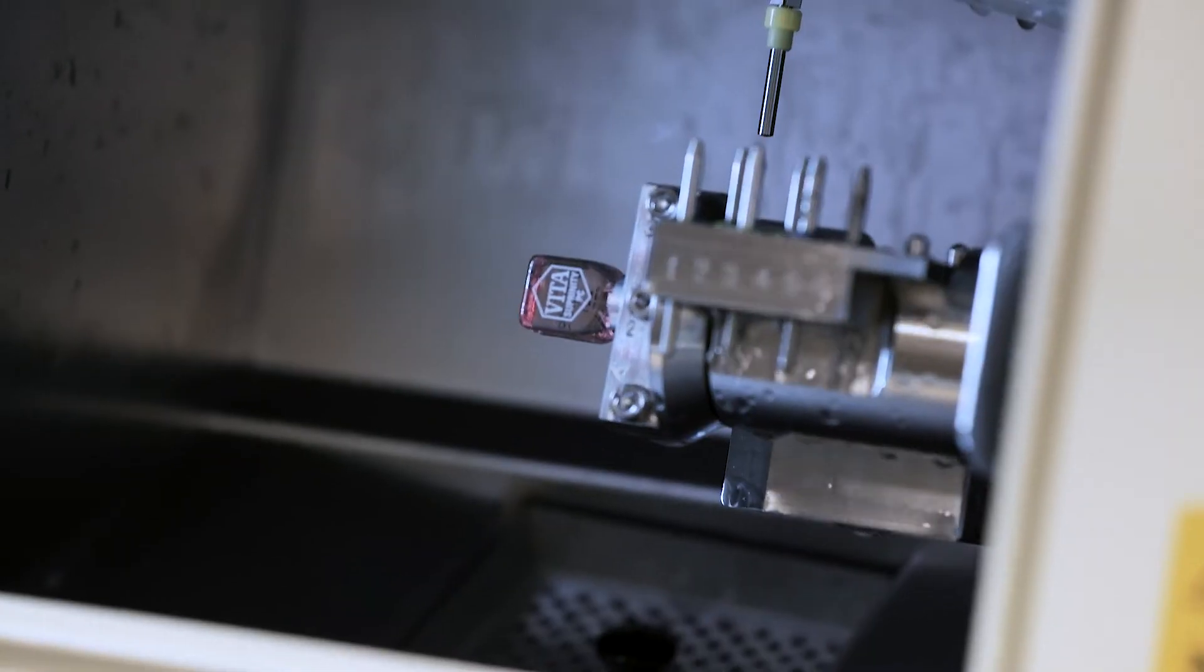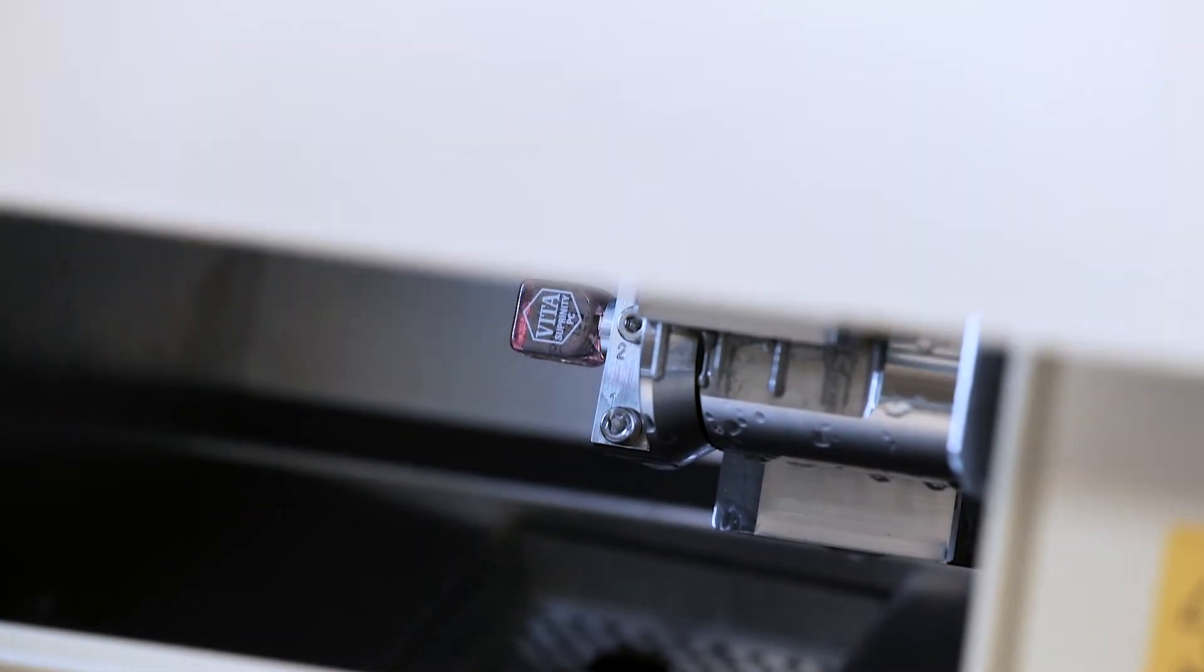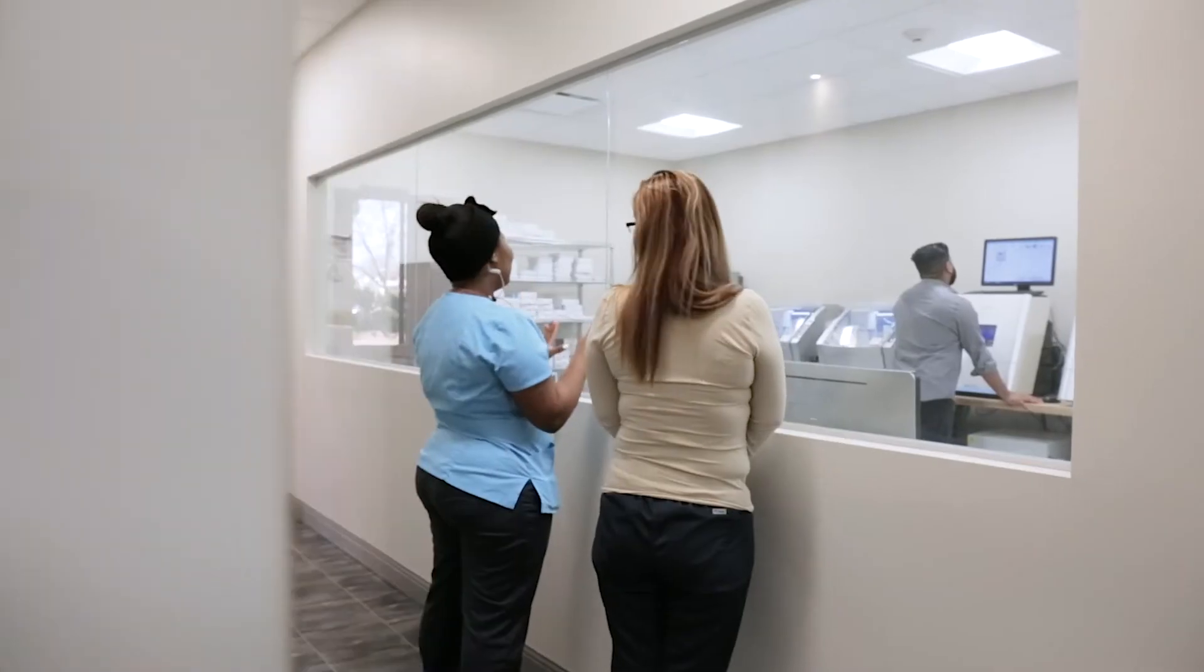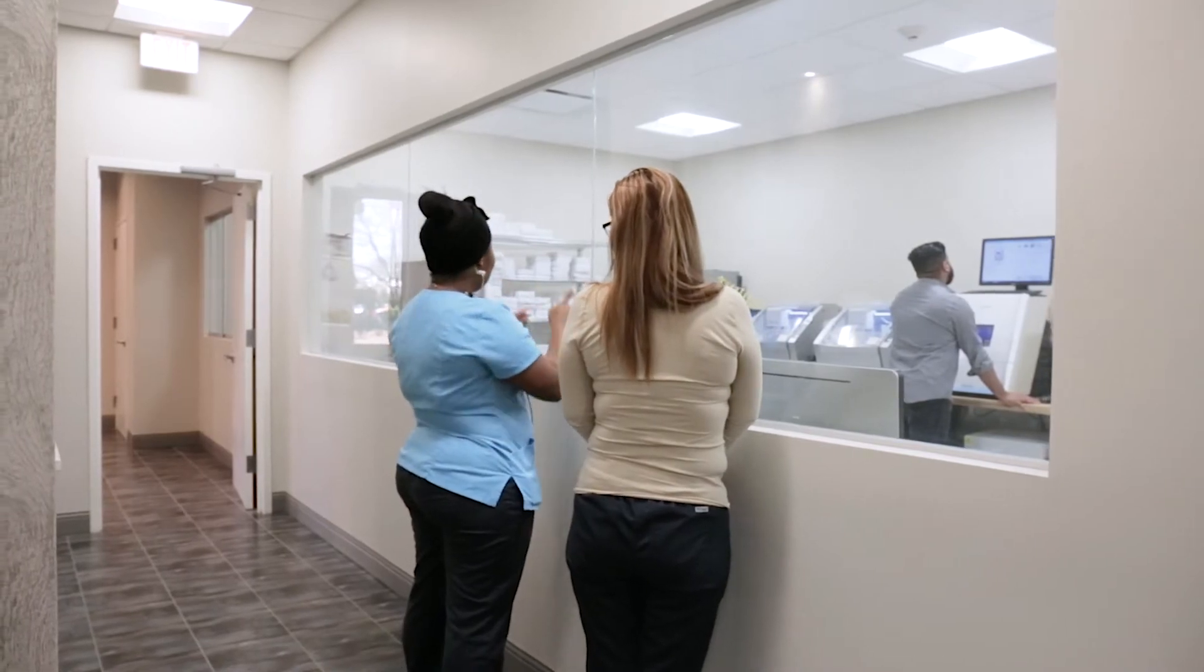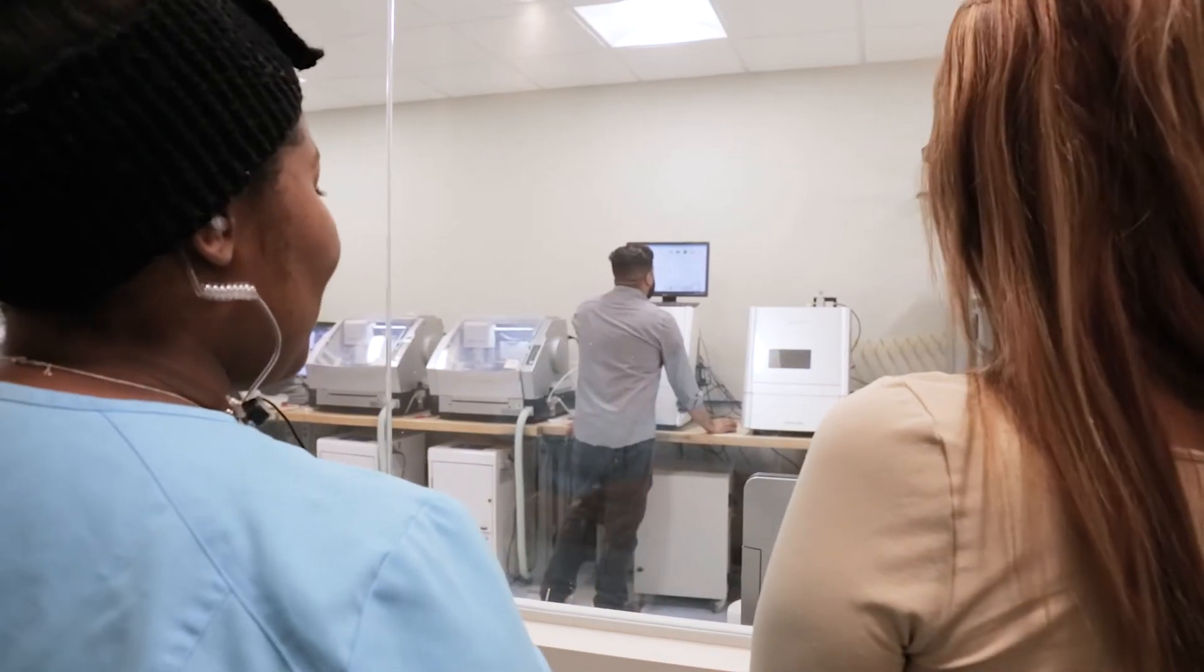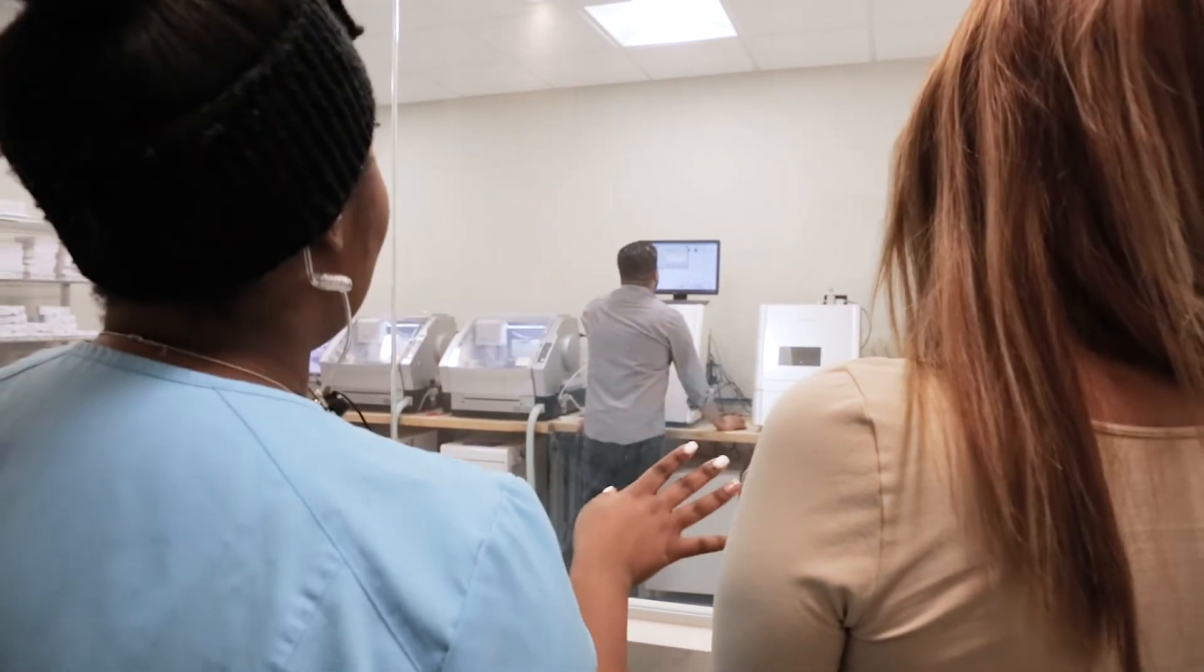They see the restorations being made, they see the process, and the patient takes that experience with them knowing they're getting the best treatment possible in our environment. It's incredibly exciting for us, especially for same-day dentistry.